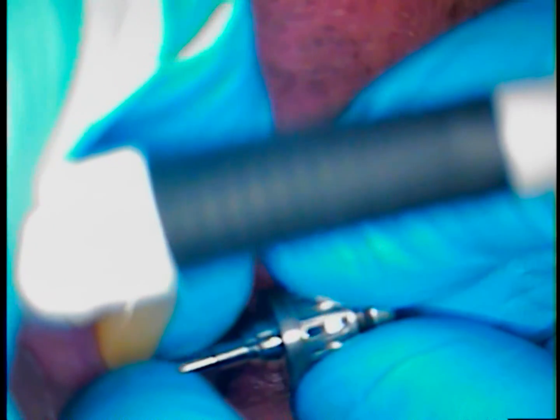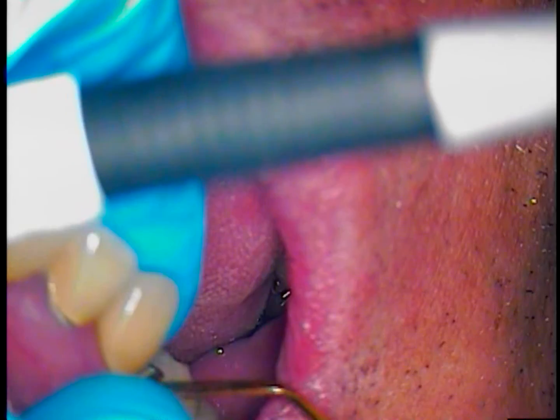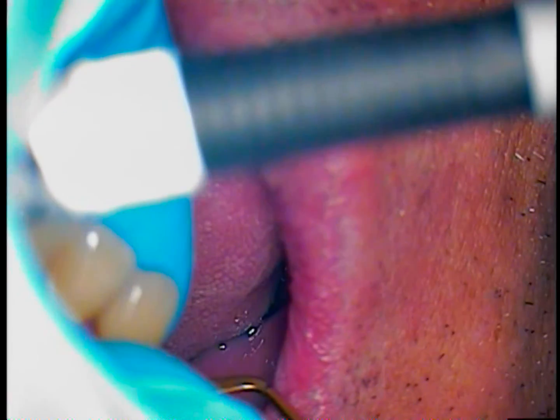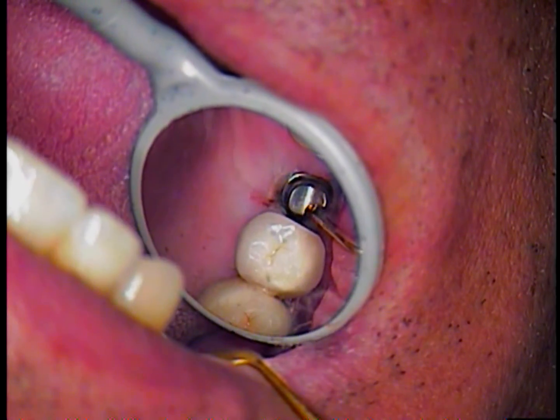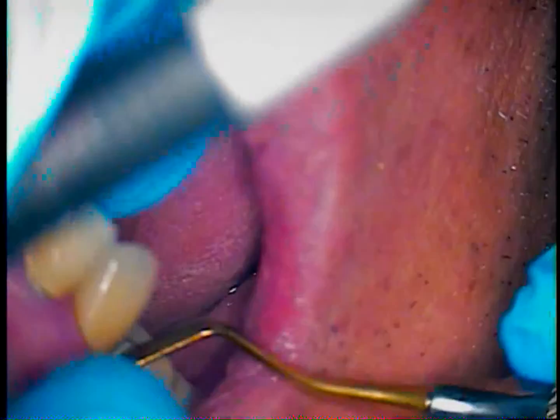So much goes into the making of a case like this. It's too easy to criticize the lab — the labs are doing the best they can in the circumstances they have. The surgeon can only place an implant in solid bone, so the rest of it is up to design. I feel there may be one slight obstacle here, but I think we can overcome that.